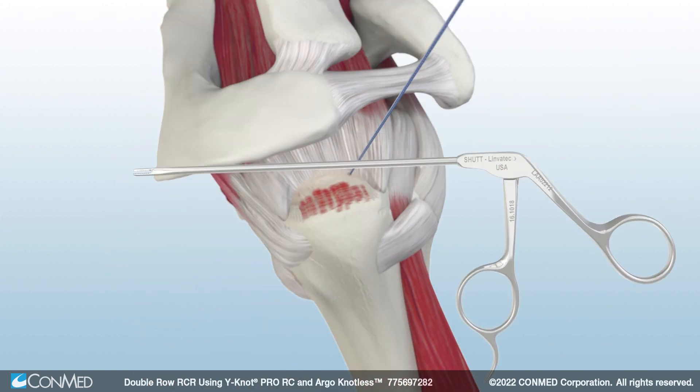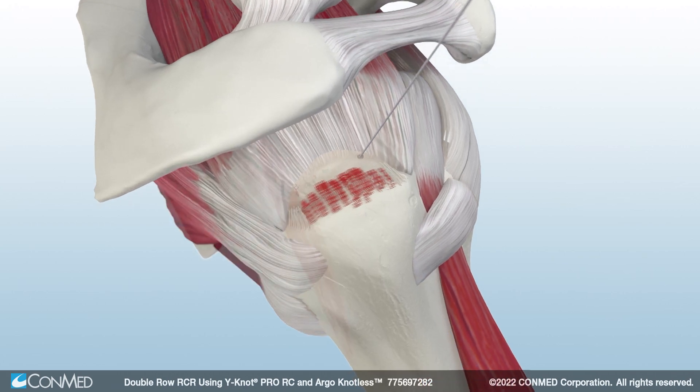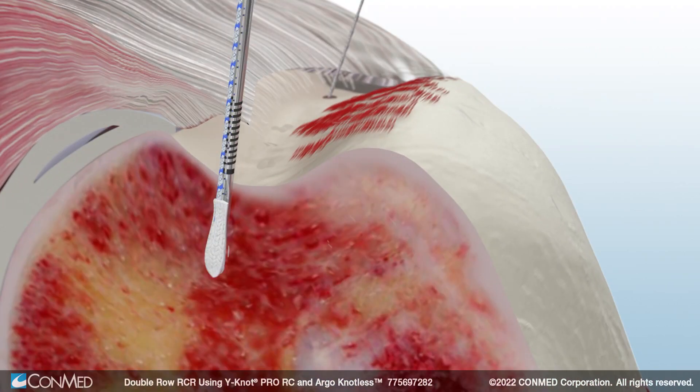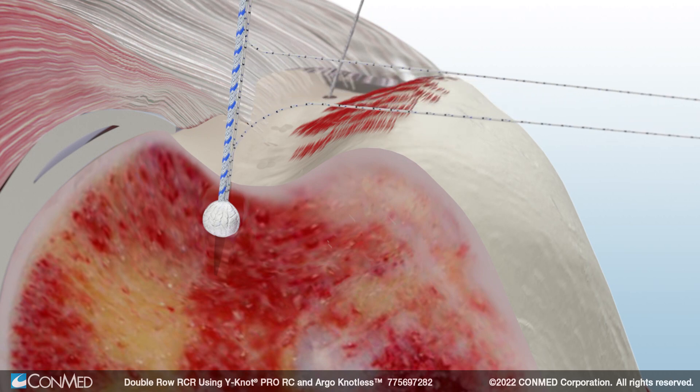Remove one strand of Hi-Fi Ribbon from the medial anchor. Next, gently mallet another Y-Knot Pro RC into the posterior insertion site found on the footprint. Remove the anchor driver and pull back on all the suture limbs to set the anchor. Remove one strand of Hi-Fi Ribbon.